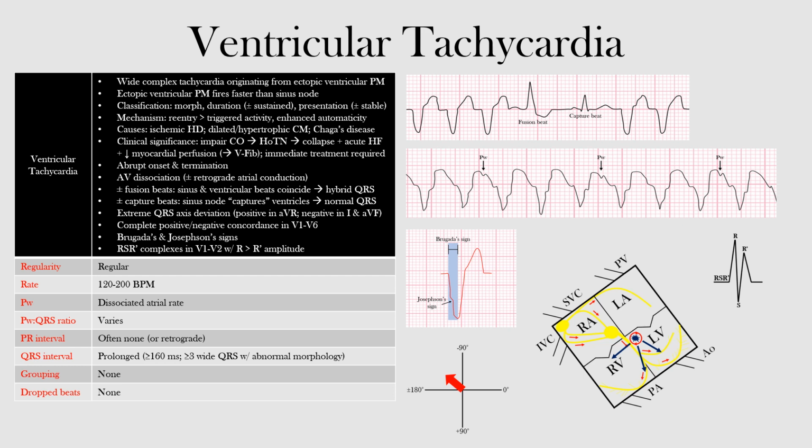So if you look here, what we have going on is this ectopic focus here in the ventricles that's firing and outcompeting our sinus node here, okay? And it's pretty much because it's coming from the ventricles and we have slow cell-to-cell depolarization, we will see these wide complexes, okay? So notice the wide complexes that we see in VTAC.